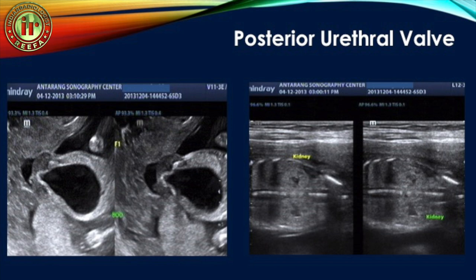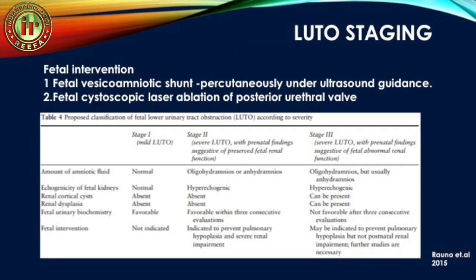Here is a case of posterior urethral valve showing a thick-walled bladder with the typical keyhole sign. The kidneys are highly echogenic and there is central calyceal dilatation. With recent advances, fetal interventions are possible in LUTO, including vesicoamniotic shunting done percutaneously under ultrasound guidance, or fetal cystoscopic laser ablation of the posterior urethral valve.